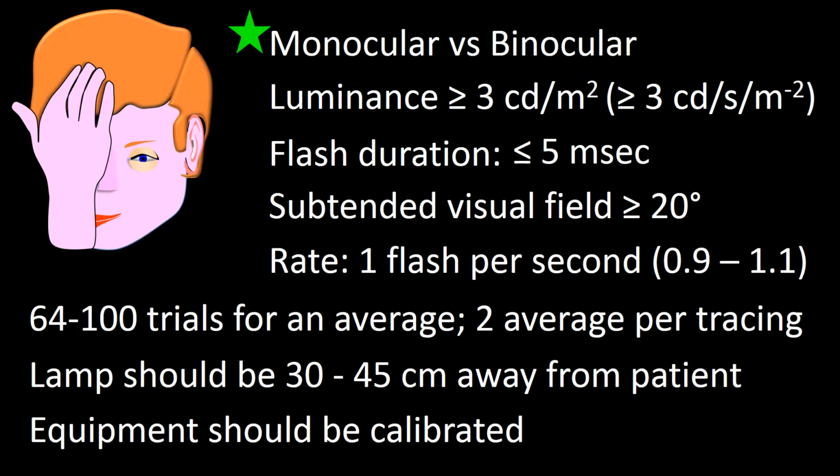It certainly should be calibrated the first time it's brought into the lab, but thereafter I find no actual number to determine when it should be recalibrated again. My guess is it should be done every year, or any time that the room or any of the parameters used in the room of the testing are changed.